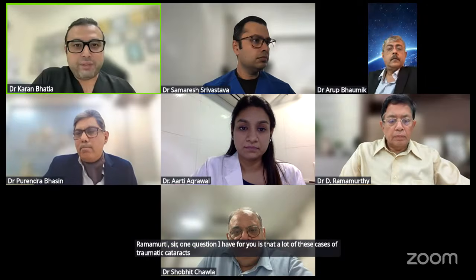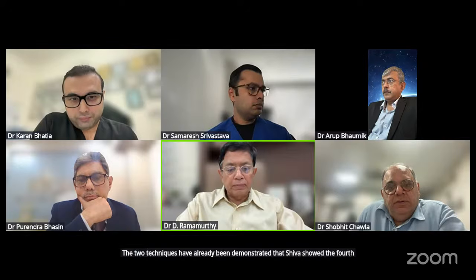Ramamurthy sir, one question I have for you is that a lot of these cases of traumatic cataracts have traumatic mydriasis also associated with it. So what would be your technique for pupilloplasty in such cases, and why? I think it's very important that the pupil and the iris are also attended to. Two techniques have already been demonstrated: Subhash showed the four-throw pupilloplasty, and Purendra showed iris segments being used. You also get intraocular lenses with an artificial iris in the periphery. They can also be used.